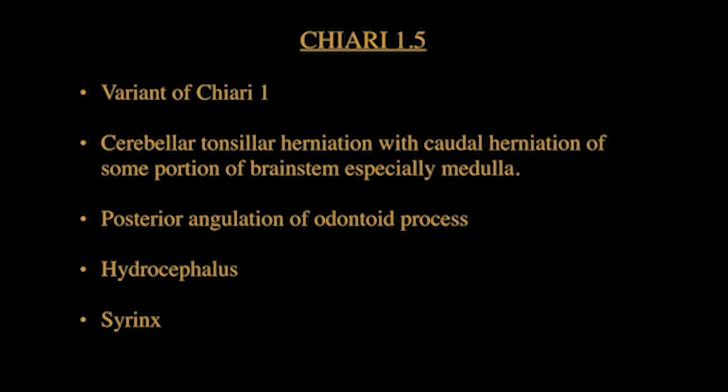Chiari 1.5 is considered a variant of Chiari 1 malformation where the caudal migration of the brainstem, especially the medulla, along with cerebellar tonsillar herniation is considered characteristic. Posterior angulation of the odontoid process can also be seen.